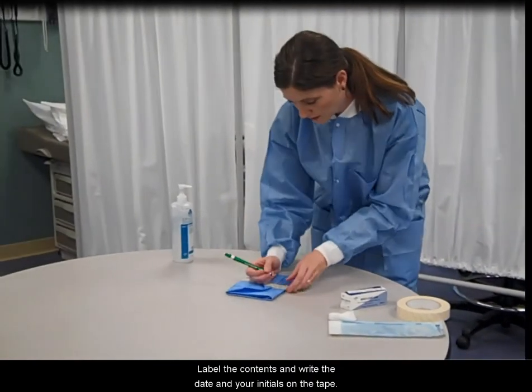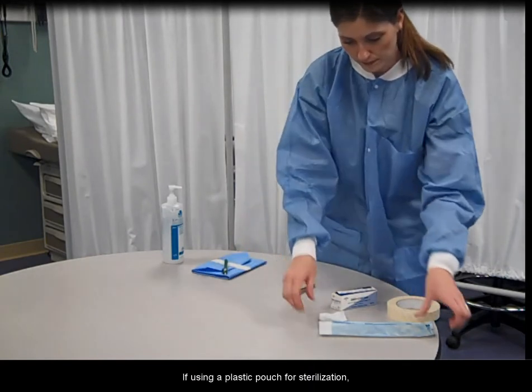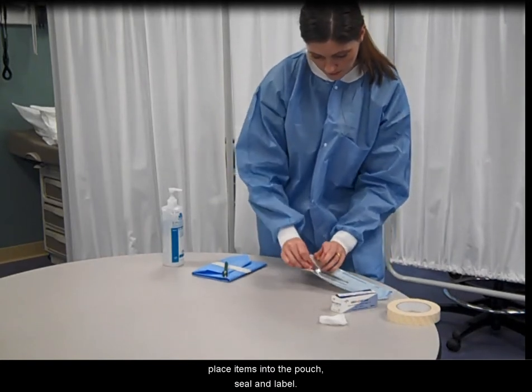Label the contents and write the date and your initials on the tape. If using a plastic pouch for sterilization, place items into the pouch, seal and label.